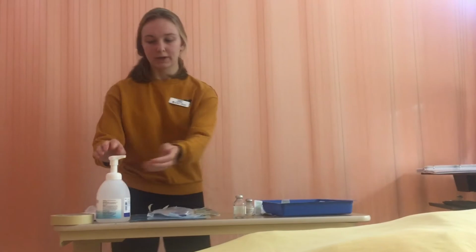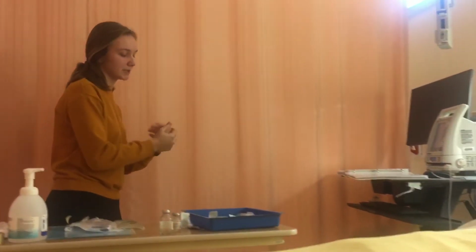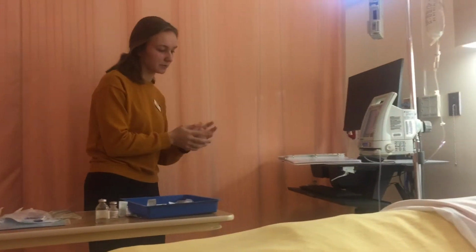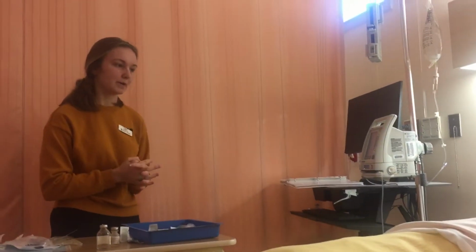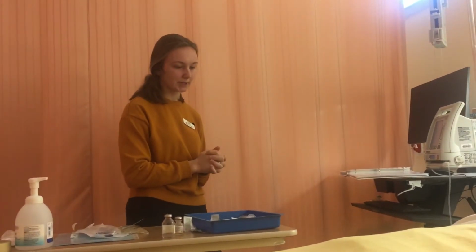So I'm going to walk in, do a safety check, wash my hands, make sure the bed's in the lowest position and the call bell's within reach and the patient's not in any visible distress. Hi, my name is Carli Reimer. I'm a student nurse, and I'm going to be giving you your medication today.